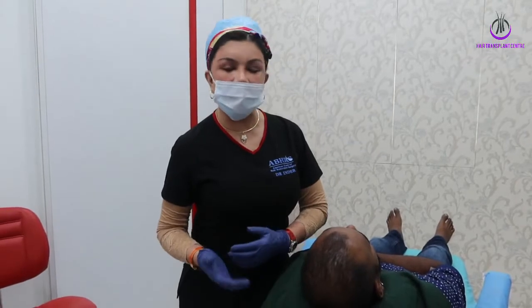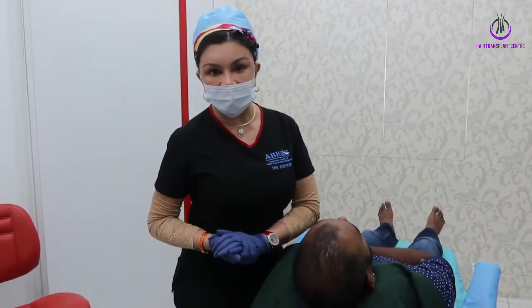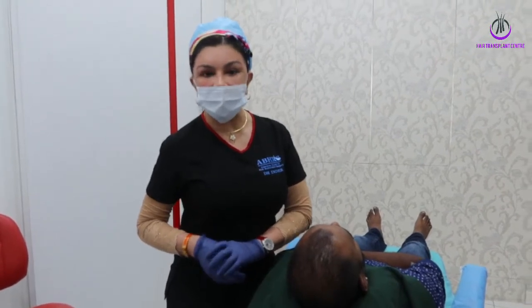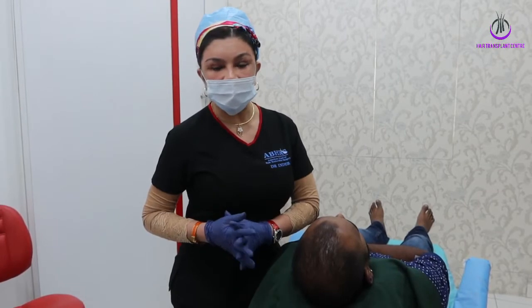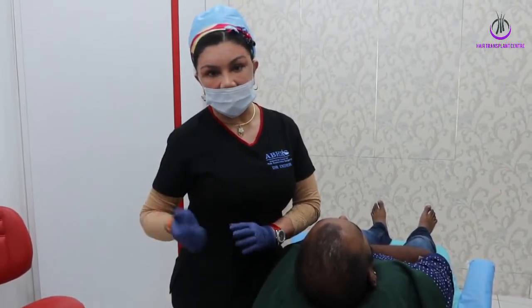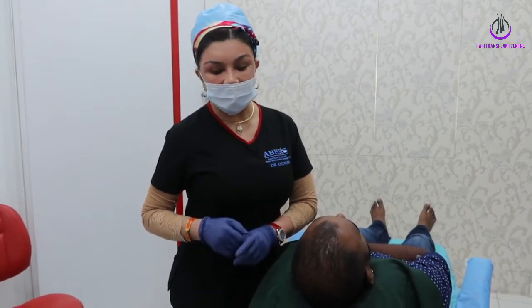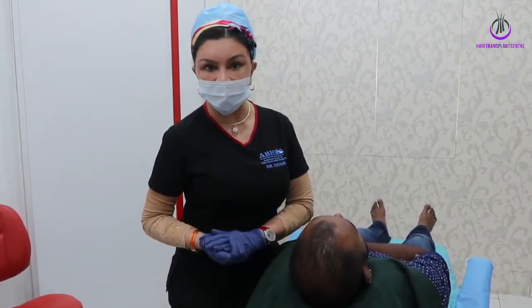As I'm doing the whole procedure, I'll be showing the steps of FUE today. The method I'm going to use is my favorite, of course, the John Cole instrument, called the PCID, to do the harvesting. And later I'll be showing the implanters and the blades and all that today.